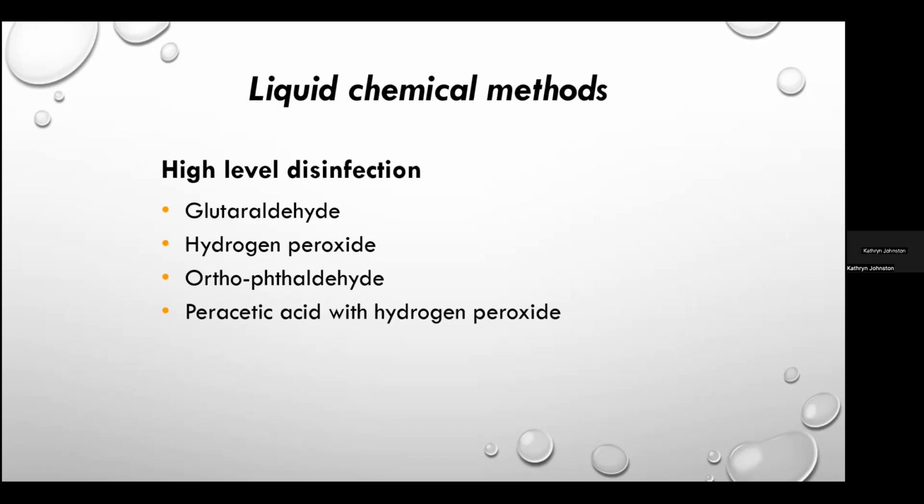And deficiencies in the disinfection process can result in serious infection or inflammatory complications if patients come in contact with the chemical agents remaining on the articles that were chemically disinfected.